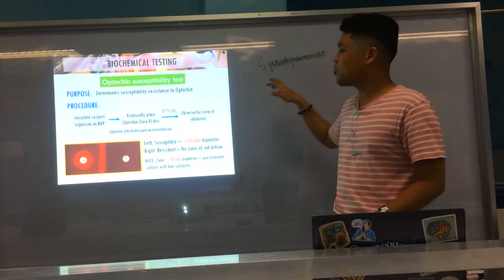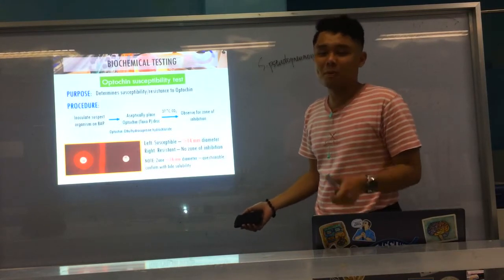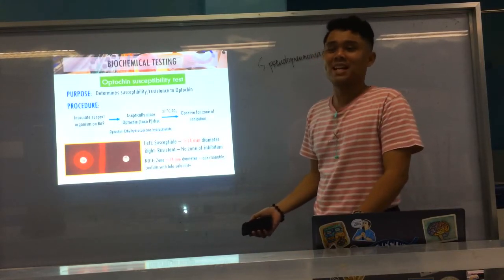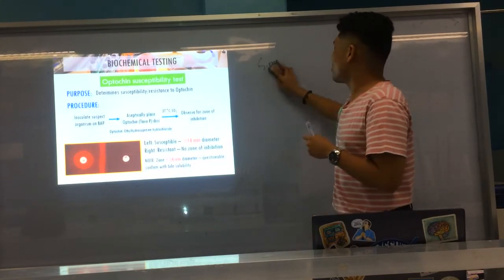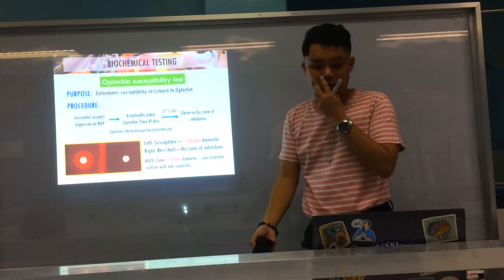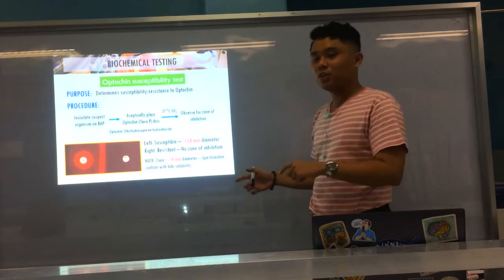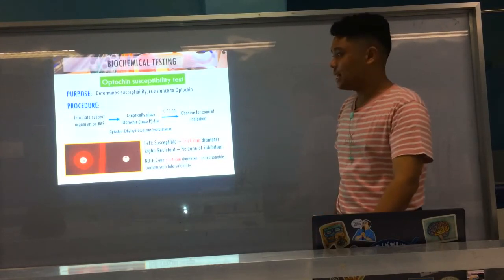So S. pseudopneumoniae is just there to confuse you; it acts as if it is S. pneumoniae, even though it isn't. Sure, okay, alright. So again, that's S. pseudopneumoniae and S. pneumoniae. If you're questionable on the Optochin susceptibility test, we proceed to the bile solubility test. You confirm it using the bile solubility test.